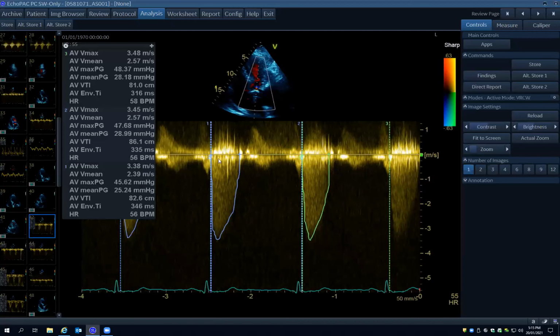And the last thing will be your baseline, to have the low velocity filter reject nice and low so you can draw back down. One of the common errors that happen here sometimes is that eccentric jets of MR and aortic stenosis can overlap. And here it's looking at your temporal association between your QRS complex and your aortic outflow jet. MR, being a pansystolic phenomenon, would start fairly early, whereas in aortic stenosis there's a bit of a lag before it starts. And we're thinking that we're dealing with aortic stenosis, and they haven't done too bad a job. I think it's reasonable. I've done a lot worse.